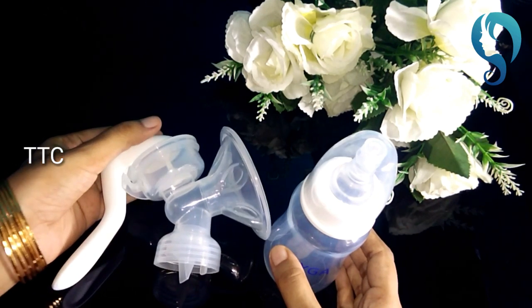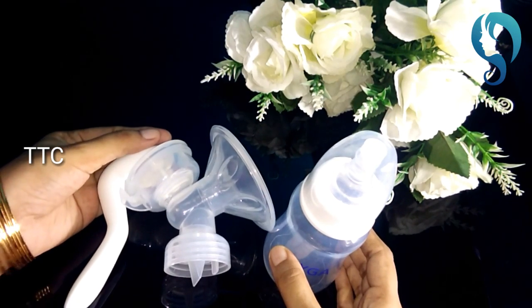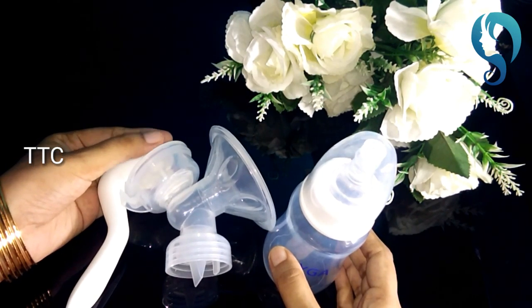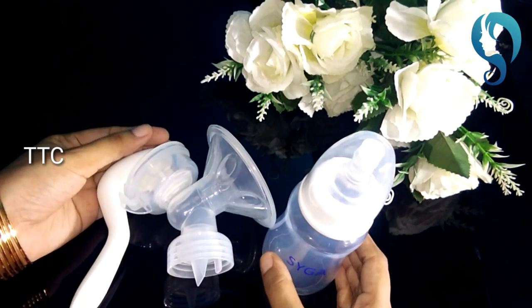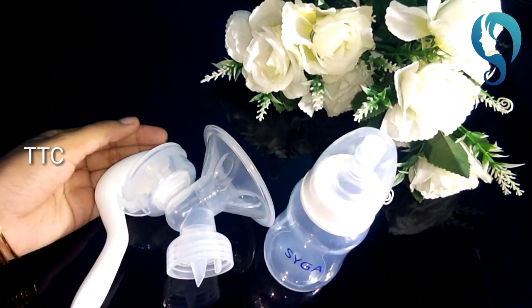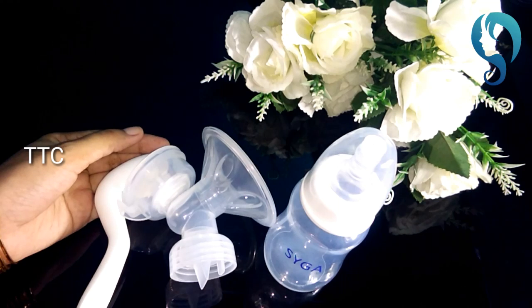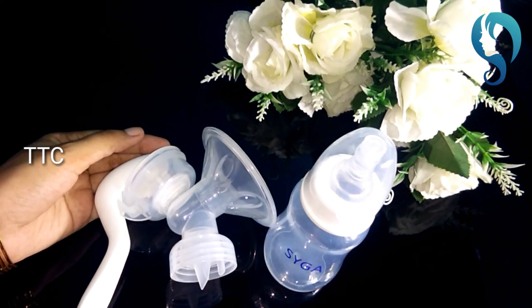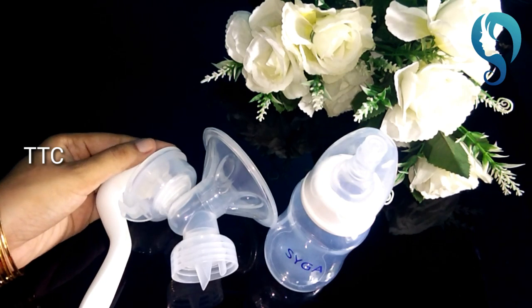You can use this when you go traveling, when you go to a function, when you go shopping — you can feed your baby from your own milk anywhere. You can fill the bottle and feed it for your baby on the go. It's a lot of fun. I'm excited. This is the best method.